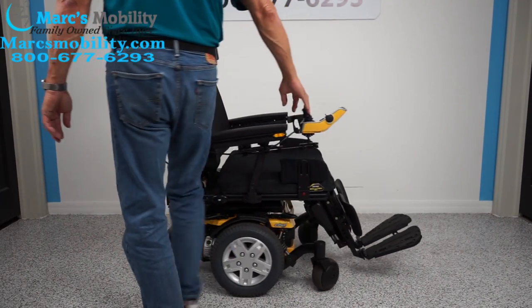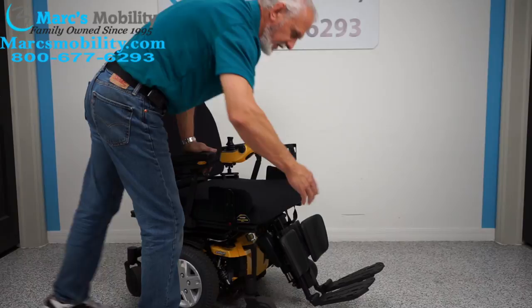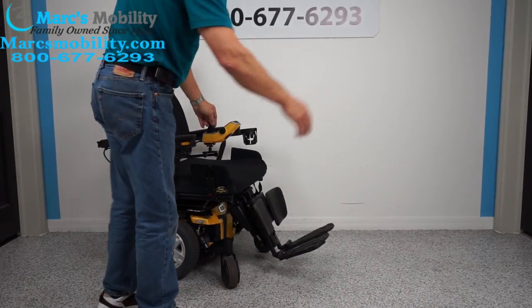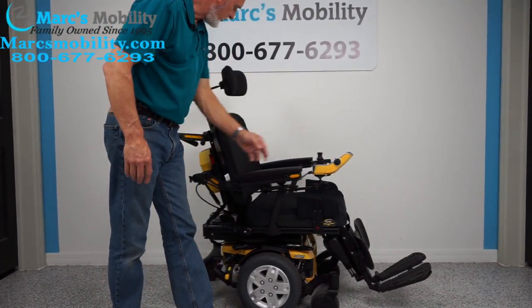If you want a better turning radius, just bring your legs all the way under — footplates all the way in. Then you'll have a shorter turning circle, especially if you're in the house. You probably don't want those legs sitting all the way out there, so if you need a tighter turning circle, that's what you would do.